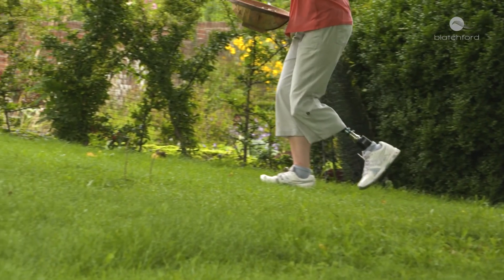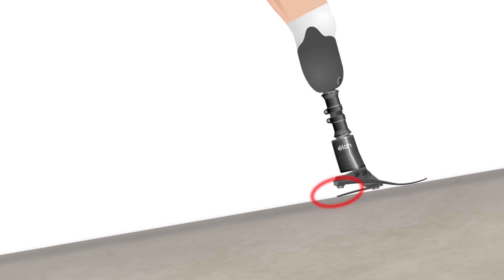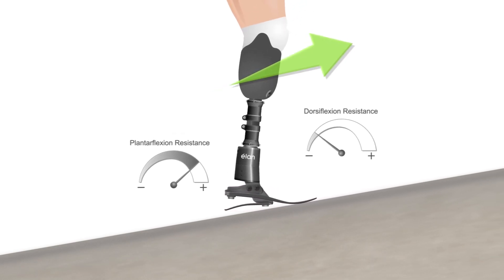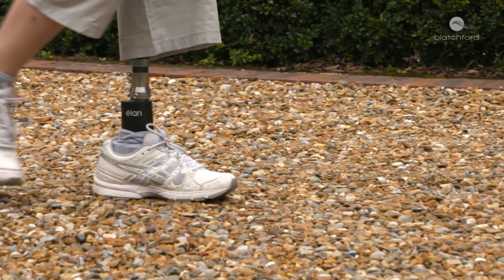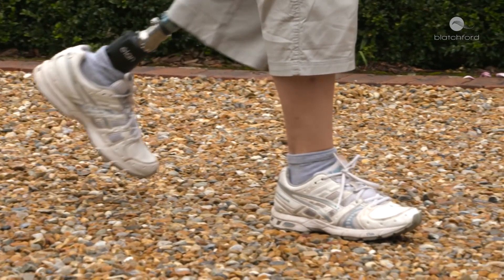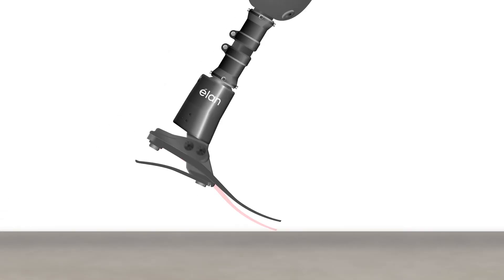When walking fast or up slopes, the heel stiffens, allowing for more optimal energy storage and return. This aids forward momentum and reduces the effort needed to walk faster or uphill. During swing phase — the time when the foot is not in contact with the ground — the ankle remains in a toe-up position, giving increased toe clearance on every step, making the user less likely to trip, stumble, or fall.